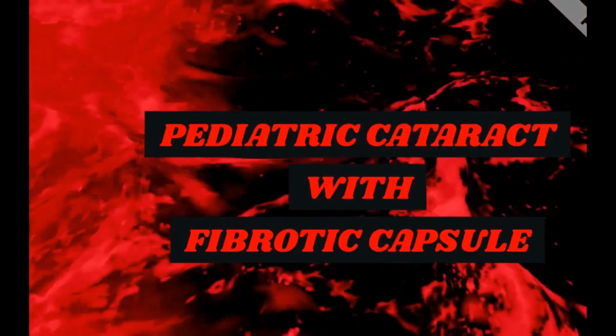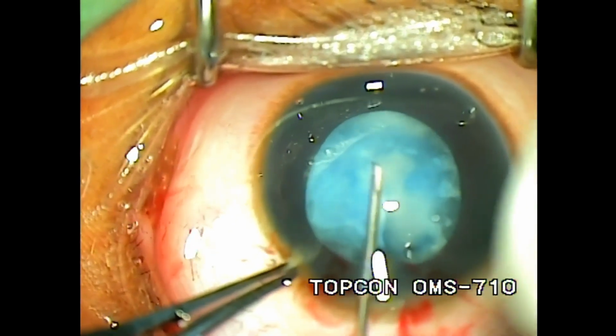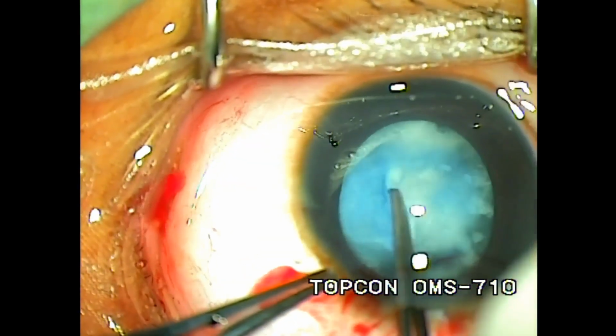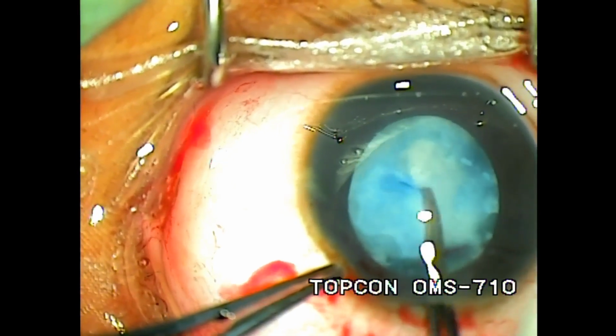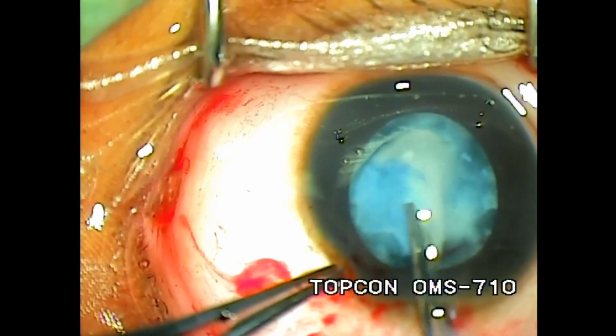Moving on to the next case, a 3-year-old female with anterior capsular fibrosis. In cases of anterior capsular fibrosis, creating an intact capsular rhexis may be difficult.